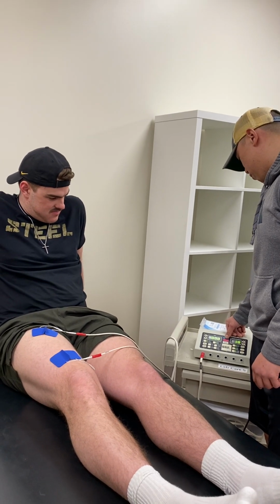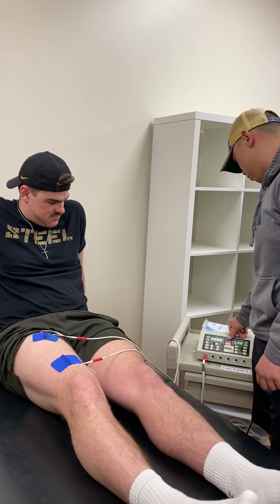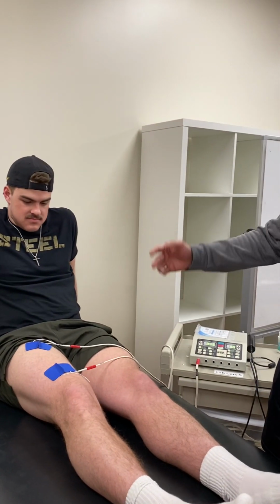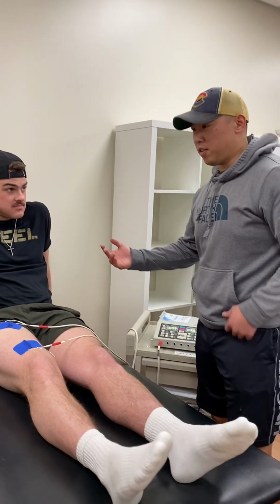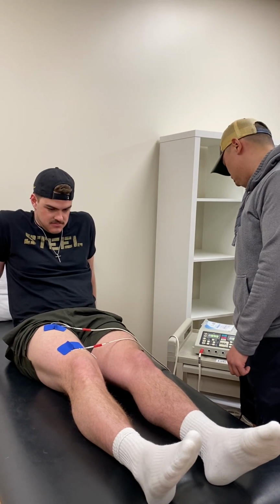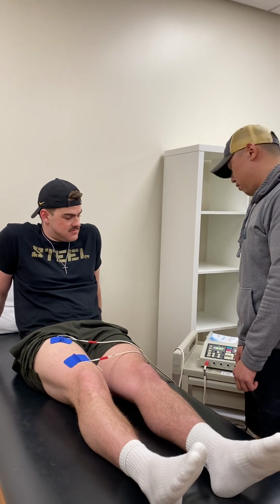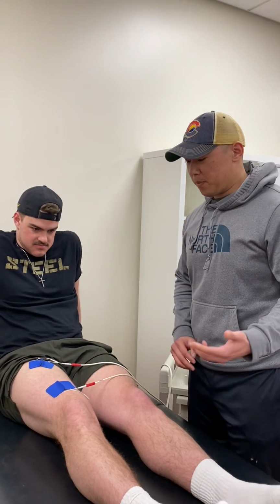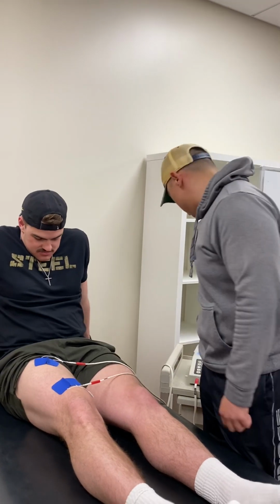And press start. So it's going to run for about 10 seconds on, 30 seconds off. We'll do this for about 10 minutes. Is it still going? It just turned off. Okay, 10 minutes has gone by. He's done about 10 reps or so.